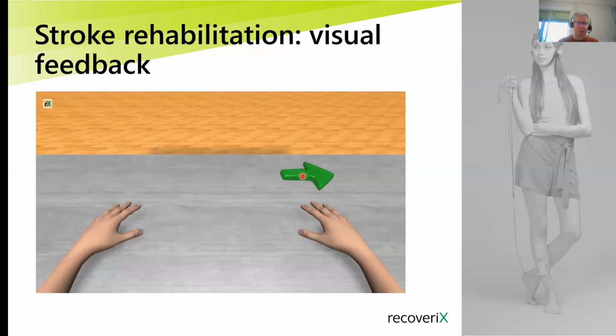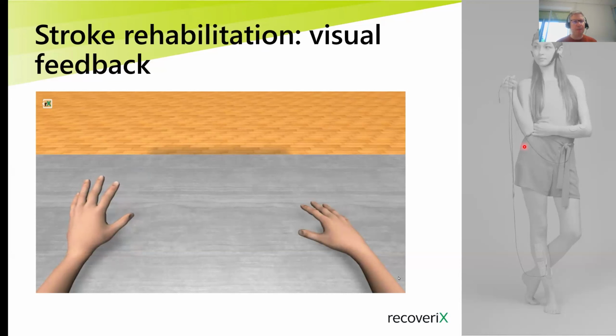Right. So this is how the visual feedback usually looks like. Relax. And I hope you also hear the audio commands. So you get the right command to do the motor imagery of your right hand, and relax. You see the movement on the screen. And now it's the same for the left hand. Relax. And this is done for in total 240 times.